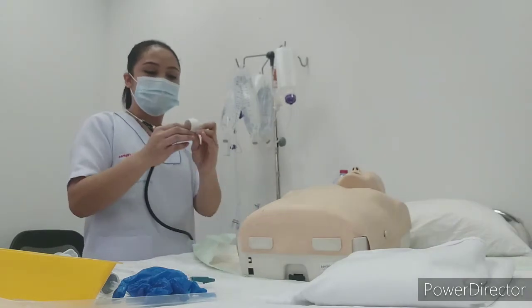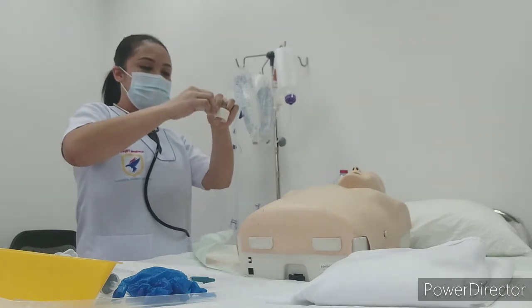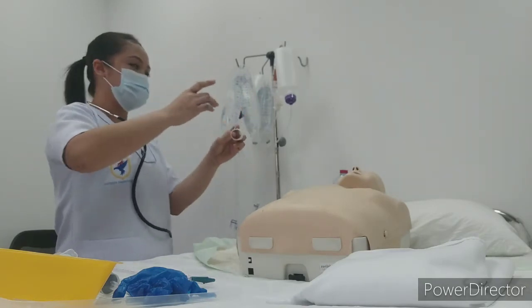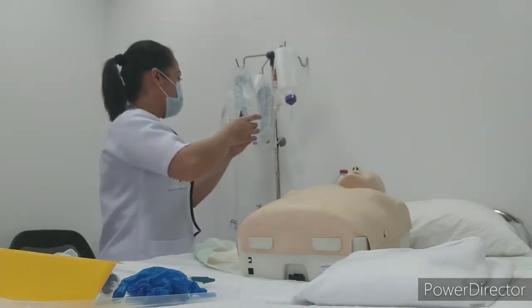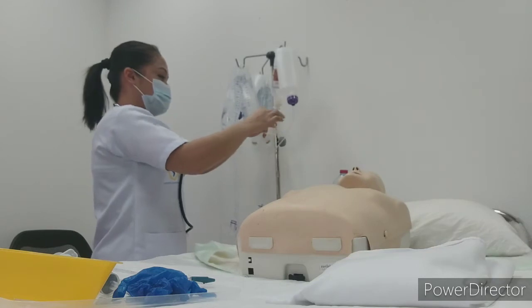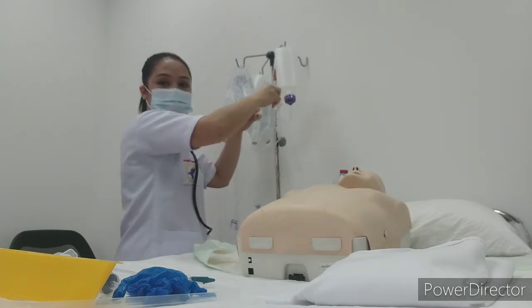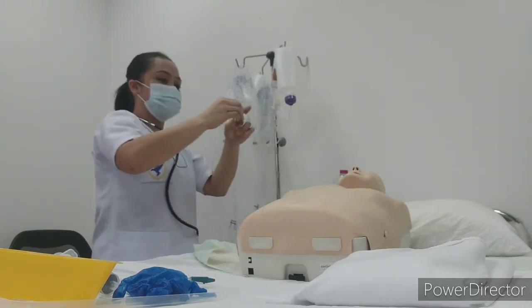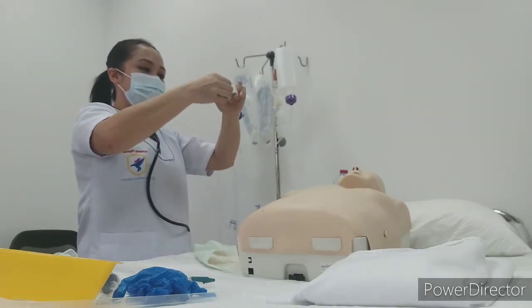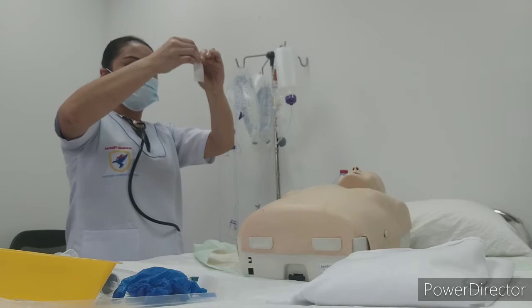First one, take the plaster, cut it into 3 pieces like 1 inch each, just enough to cover the nose. You will place this one just near you so that it will be easy for you to take the plaster. For example here in the bar, or you can put it here on your arm. So 3 pieces, 1 inch. And then the fourth one, around 1.5 or 2 inches, you will cut here at the center for the nasal bridge.